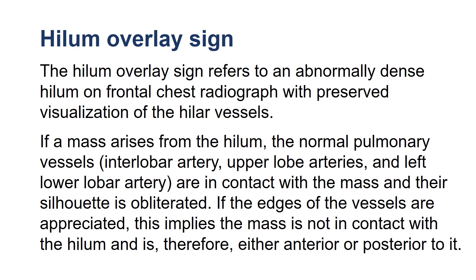The hilum overlay sign refers to an abnormally dense hilum on frontal chest radiograph with preserved visualization of the hilar vessels. If a mass arises from the hilum, the normal pulmonary vessels — interlobar artery, upper lobe arteries, and left lower lobar artery — are in contact with the mass and their silhouette is obliterated. If the edges of the vessels are appreciated, this implies the mass is not in contact with the hilum and is therefore either anterior or posterior to it.